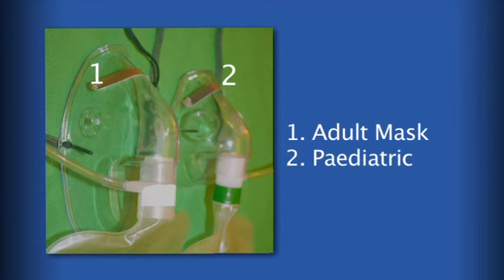When using face masks for children, always use the correct paediatric-sized face mask and maintain relatively high oxygen flow rates to prevent them from rebreathing their exhaled carbon dioxide. Only nasal prongs will safely allow much lower oxygen flow rates. This safety point, to prevent rebreathing of carbon dioxide, is explained in more detail in the appendix.